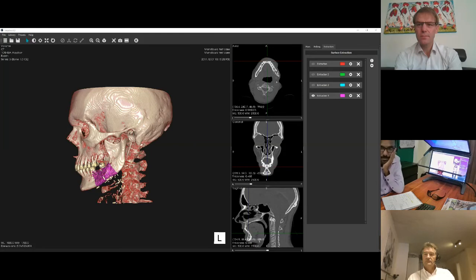However, so far our experience has been that we've been able to do almost anything. But if a scan is just a surface scan or just a one slice scan, then there is basically no point in uploading it into 3D. So that would be the little answer to that one.